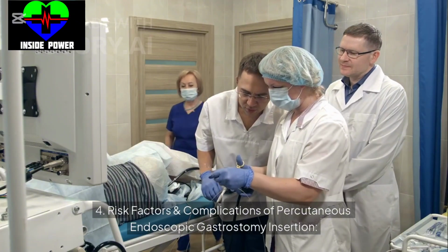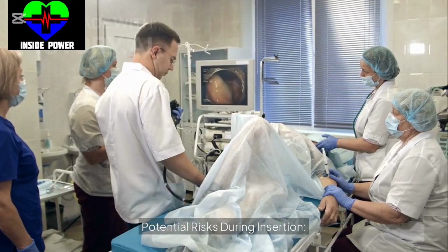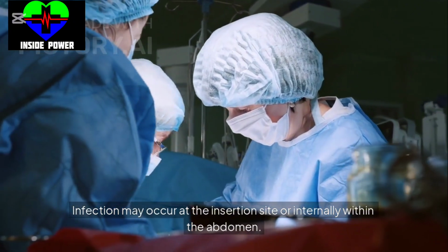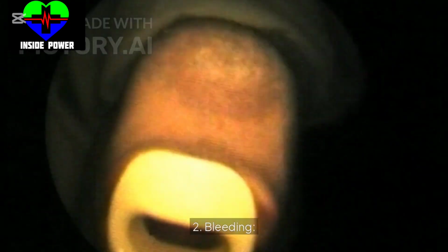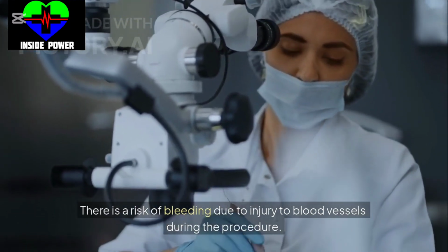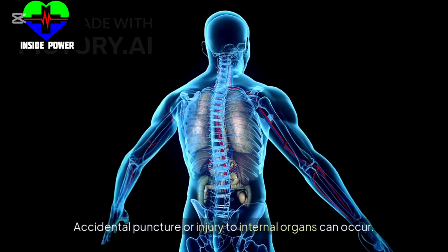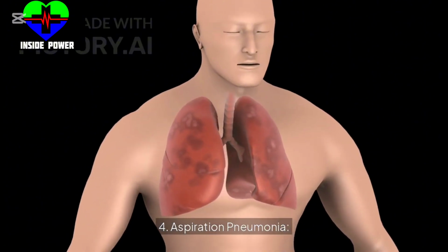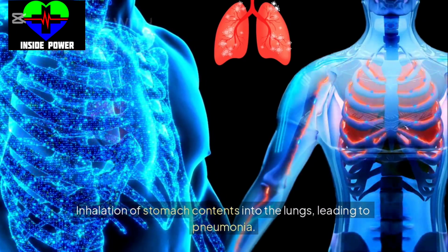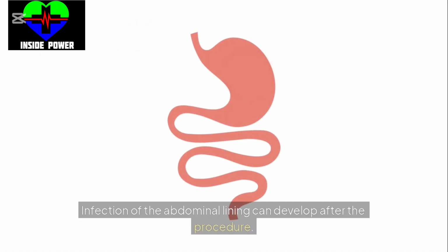4. Risk factors and complications of percutaneous endoscopic gastrostomy insertion. Potential risks during insertion. 1. Infection. Infection may occur at the insertion site or internally within the abdomen. 2. Bleeding. There is a risk of bleeding due to injury to blood vessels during the procedure. 3. Perforation. Accidental puncture or injury to internal organs can occur. 4. Aspiration pneumonia. Inhalation of stomach contents into the lungs, leading to pneumonia. 5. Peritonitis. Infection of the abdominal lining can develop after the procedure.